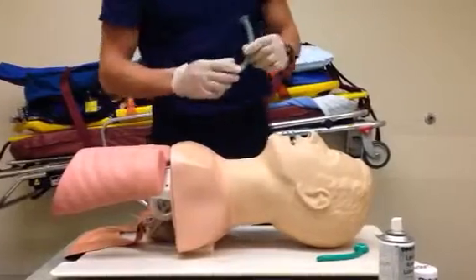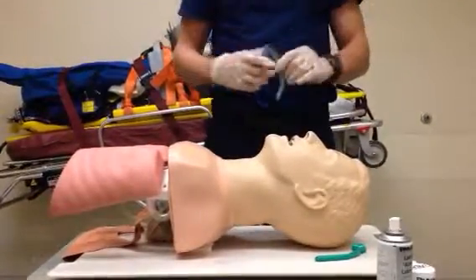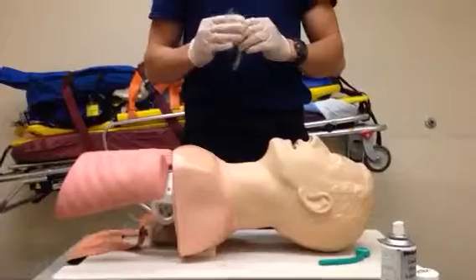Contraindications for using an NPA include when you suspect a possible basal skull fracture. There's a slight risk that you can actually insert this into the cranium, which is very bad for a patient. And that's how you insert the nasopharyngeal airway.